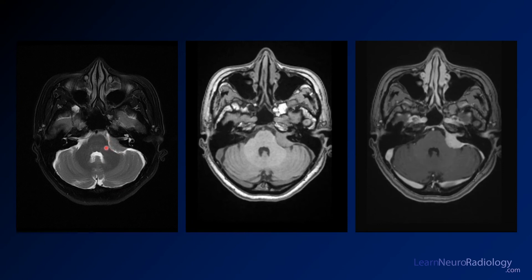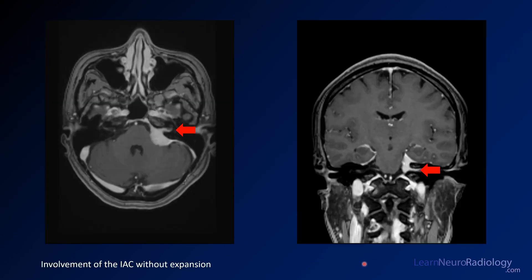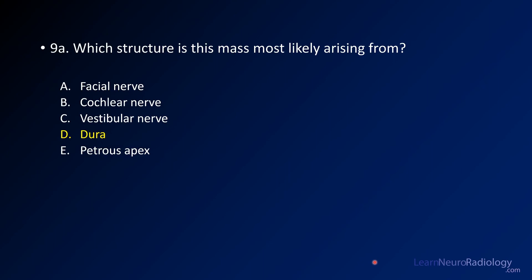Here you see the lesion in the left cerebellar pontine angle. On T2, there is a nice CSF cleft between the mass and the middle cerebellar peduncle, confirming it's extra-axial. On pre-contrast it's relatively homogeneous with extension toward the internal auditory canal. On post-contrast there is a small extension into the IAC and possibly a dural tail, which favors meningioma. The IAC is involved but not particularly expanded — it's crawling along the canal rather than centered within or expanding it.